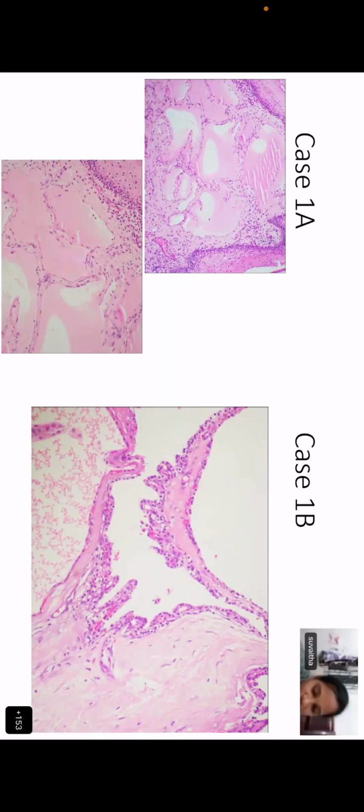It is lined by flattened epithelium, ma'am. I think it is a secretion, ma'am. You still think that is flattened epithelium? Yes, ma'am. All right. Very good. And what do you think, Suveta, about 1B? That's also epithelium, yes, ma'am. Flattened to low cuboidal epithelium.